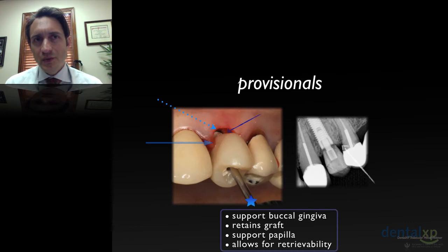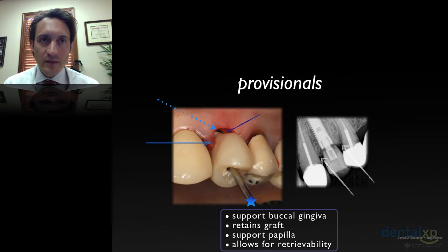And again, with provisionals, when we look at these radiographically, we can see that if you leave these in, there's been a lot of talk of one abutment one time, or getting as close to that as we can. I try not to remove provisionals for 6 weeks. I like them to stay in while the bone matures, for us to have a nice junctional epithelium present, and for the tissues to mature. Then I'll remove as necessary and Ostell and maybe load early.